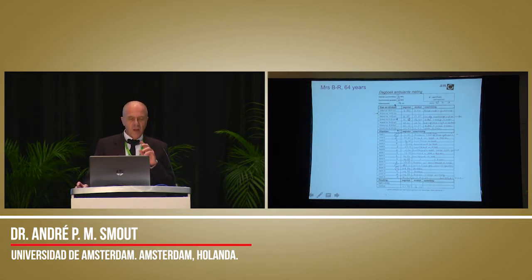For this, we instruct the patients very carefully before they are sent home with the equipment. And we give them this diary. This is in Dutch, but I'm sure you can understand it. This is diary, ambulatory measurement. And here are the periods of eating and drinking. And here are the symptom episodes noted by the patient in her Dutch writing. And many of these are zuurbrand. And zuurbrand means heartburn. And there are also a few hoest, that is cough.